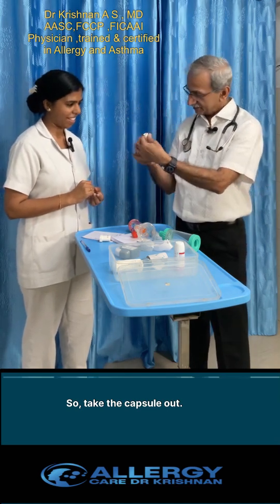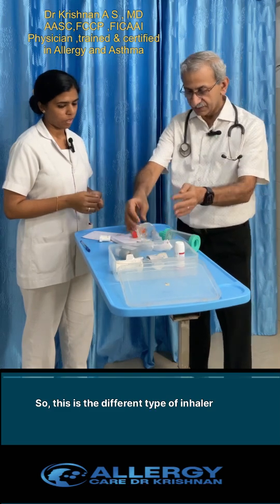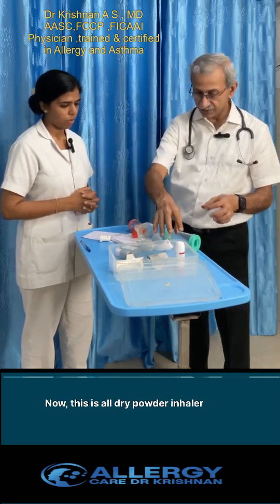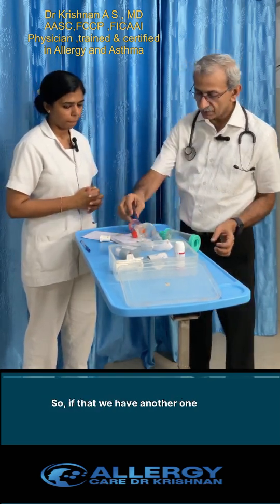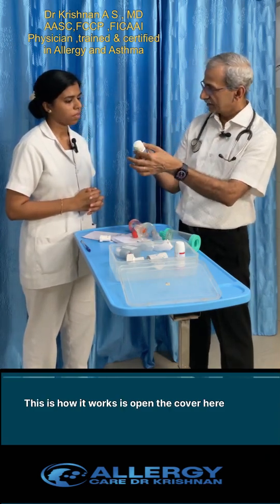Take the medicine in. This is a different type of unit — all dry powder. With that, we also have another type of inhaler, which works differently.